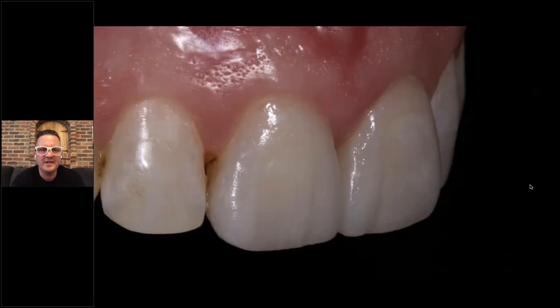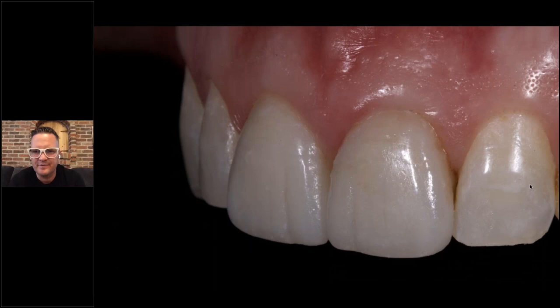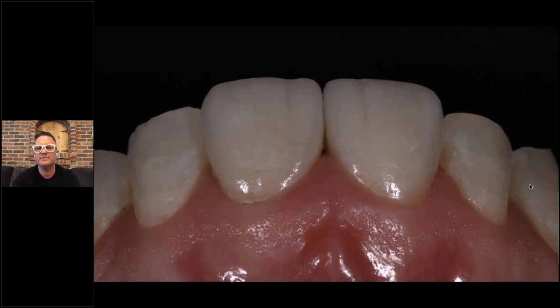But here you can see how well it integrated with the surrounding dentition. Look at that lateral and then look over at the gingival there. Again, that's great dentistry coupled with a great dental product. We used photo communication, because obviously he's in New York, but a lot of us work this way. We just have to have really good communication and good references. I was really happy with this case, and we were able to get a good match and get some of those weird grays and white stain in there.